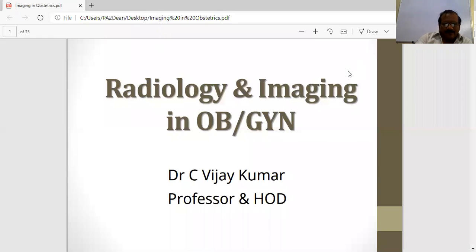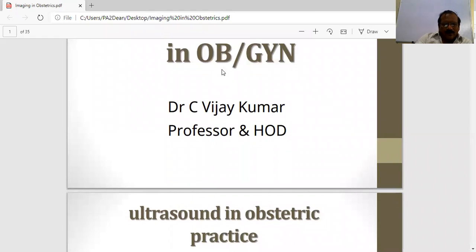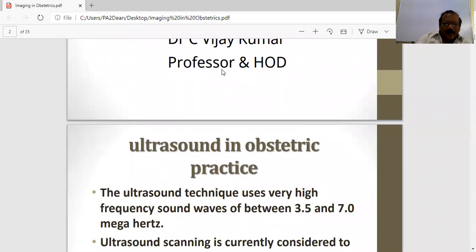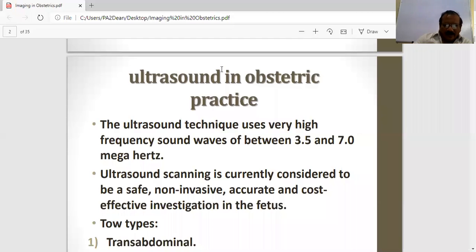Good afternoon, everybody. Today we shall discuss radiology and imaging in obstetrics and gynecology, where we have to seek the help of the radio diagnostic people. In this, mainly ultrasound is important in obstetric practice, because now besides clinical examination, ultrasound is the next immediate investigation required for obstetric practice.